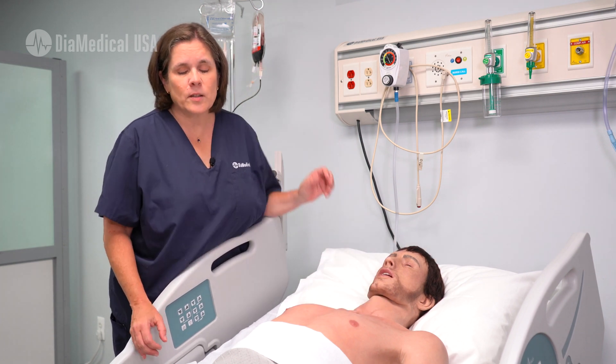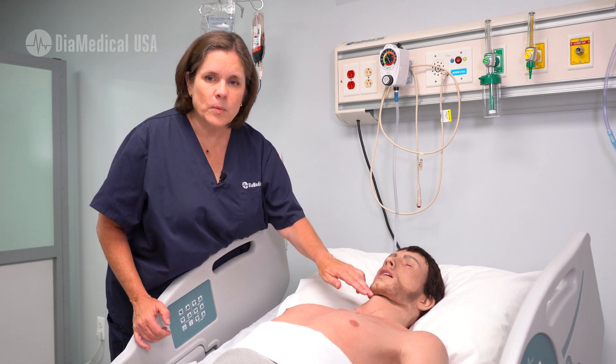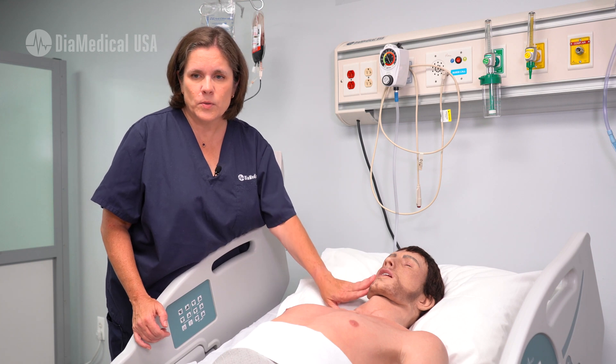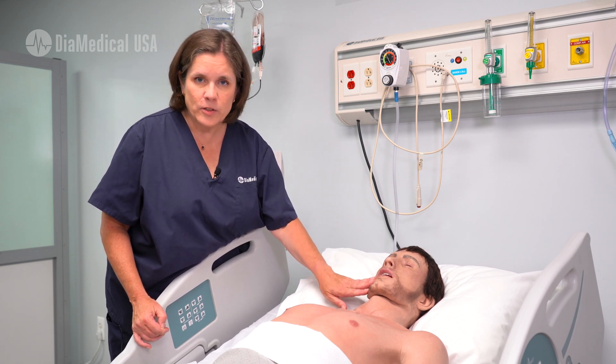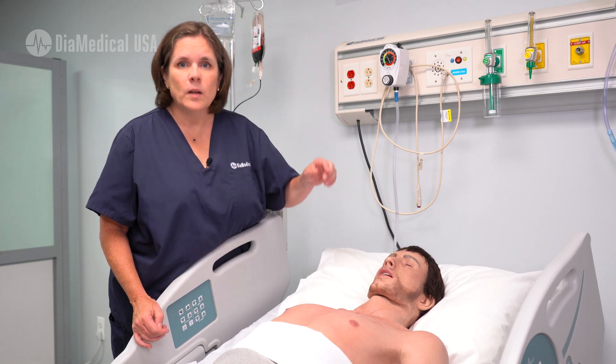His airway is actually casted from an actual human cadaver, so it's anatomically correct all the way down to the carina. He can be intubated. You can use all sorts of advanced airway adjuncts, and you can also insert NG tubes down into his stomach.